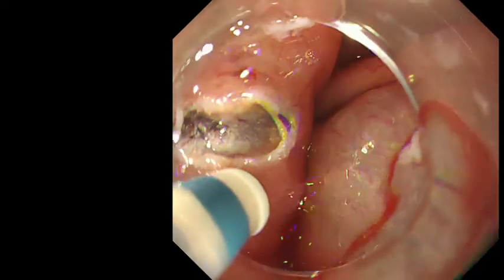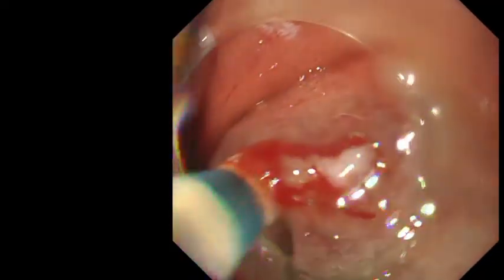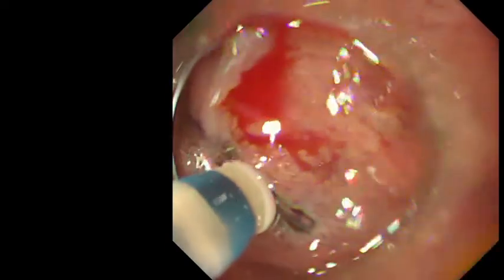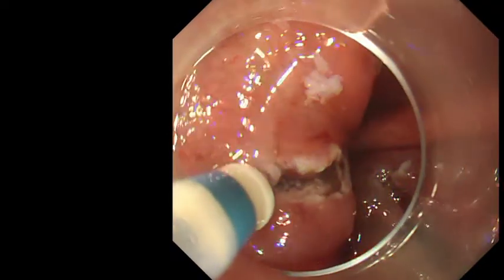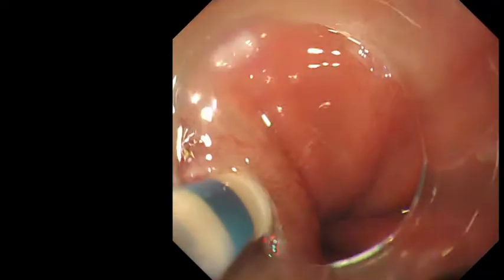And you will see on the left, the incision is not very deep. There is still muscularis mucosa in the incision. But on the right, because the mucosa is very stretched by the injection, you can see that your first incision is deeper and easier to do with a good trimming immediately. Also on the left, the mucosa is still thick and more difficult to cut.